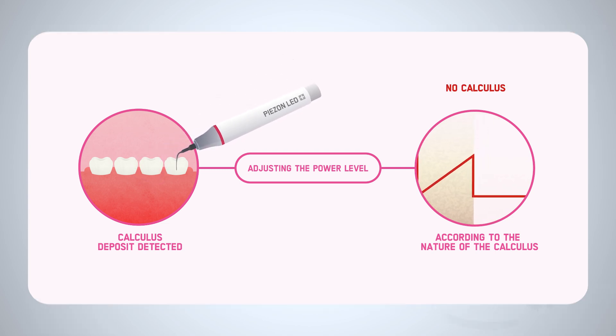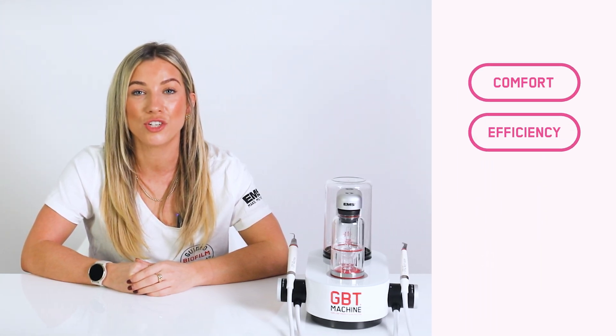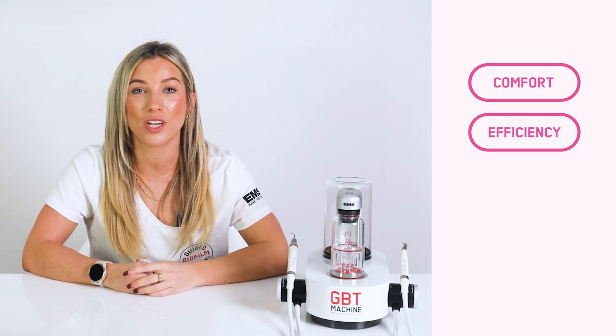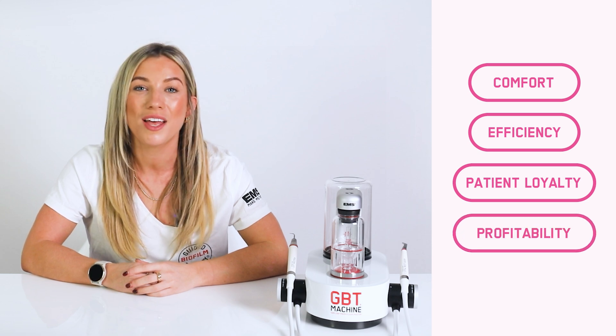This innovative feature enhances patient care in several ways. Minimally invasive treatments tailored to individual needs ensure patient comfort. Precise power adjustments ensure effective calculus removal, creating a superior patient experience that fosters trust, satisfaction, and patient loyalty. Enhanced efficiency and quality of care support your long-term practice growth. The PIZON No Pain Max module redefines patient care, empowering clinicians to deliver premium treatments while maintaining high standards of comfort and efficiency. Elevate your practice with a solution that prioritizes patient well-being and optimizes your prophylaxis workflow.